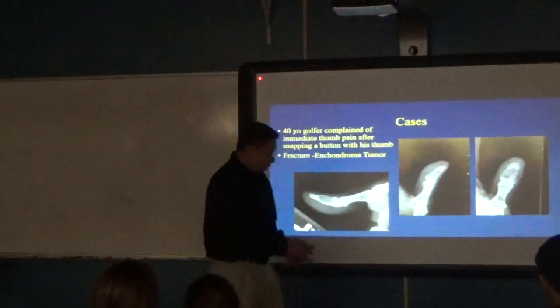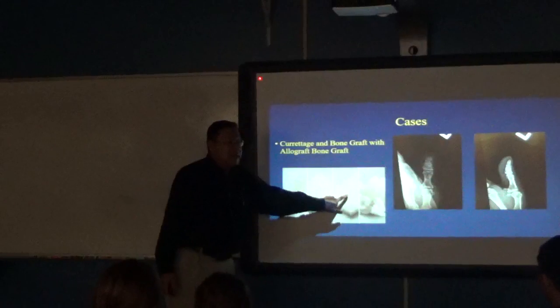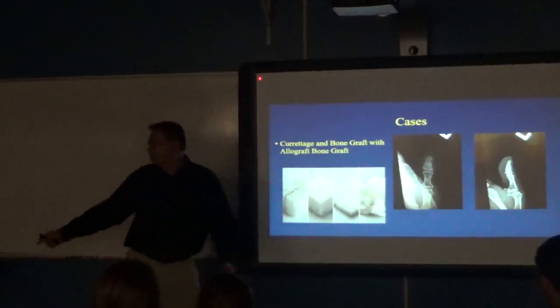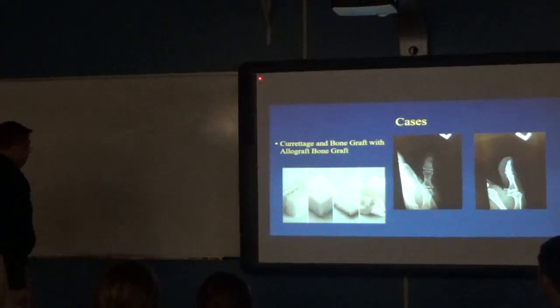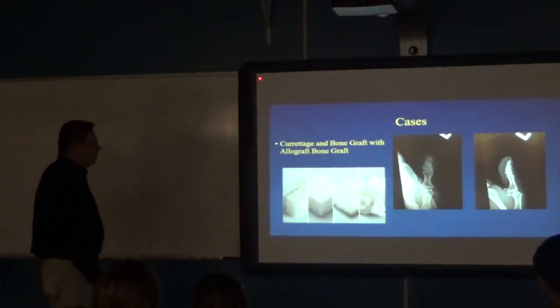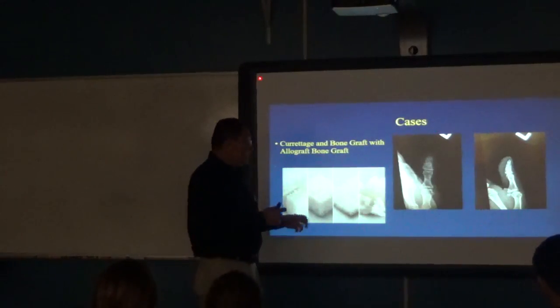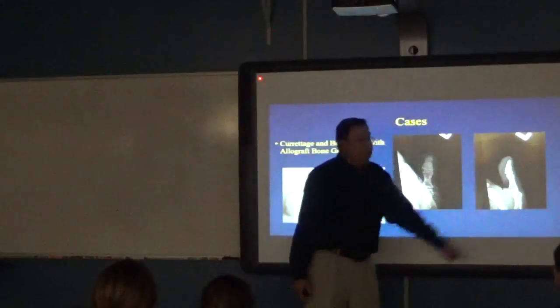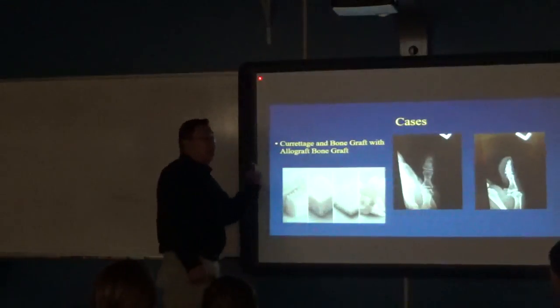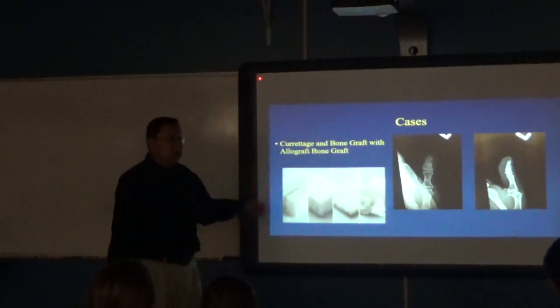So what we do is we took some bone graft, croutons. These are volunteer cadaver graft, from marrow. Croutons. So we take some of this and crunch it up, draw some blood and put it in here, and pack it into the marrow. And your body, the osteoclasts and the osteoblasts, will start remodeling that and kicking in, stimulating bone growth again.